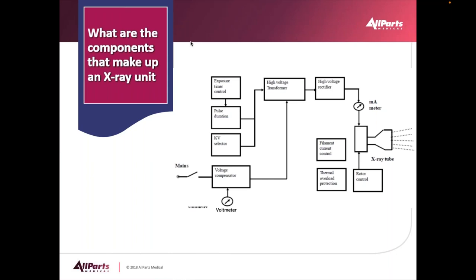And we have to have an X-ray tube. What's around that X-ray tube, we've got to have a filament control. The filaments are like a light bulb. They're little coil filaments that create this electron cloud that we need to send downstream to the metal plate called the anode to create the X-ray. So we have to have something that would control that so we can control the output.